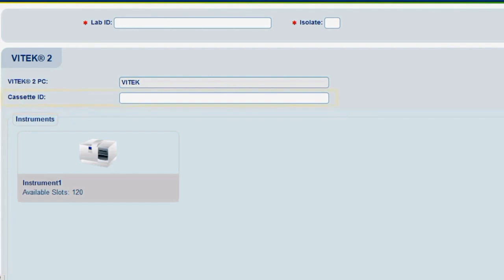Click in the Cassette ID field. Enter an alphanumeric code, up to four digits, to uniquely identify the cassette.